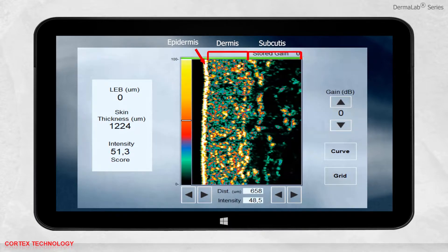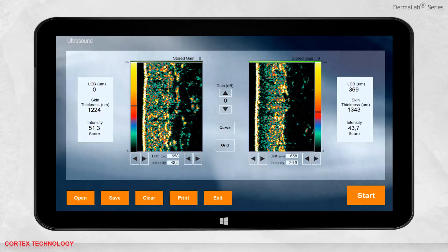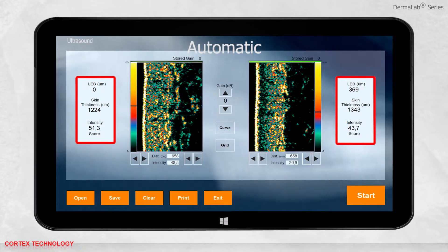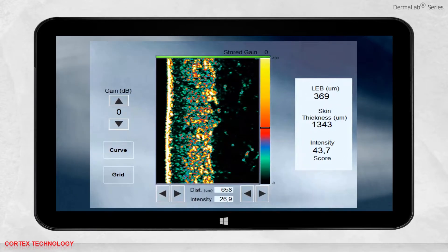The subcutaneous fat and muscle fibers will return a low-level reflection, to a max depth of 3.4 millimeters. A second image may be recorded or retrieved from memory to be displayed in the other window. The two images displayed represent the forearm skin of a 20 and 60 year old respectively. The Dermalab features both automatic and manual measurements. Automatic measurements include skin thickness presented in micrometers and average reflection strength of the dermis represented as the intensity score.